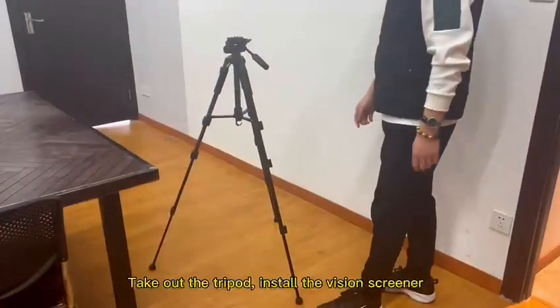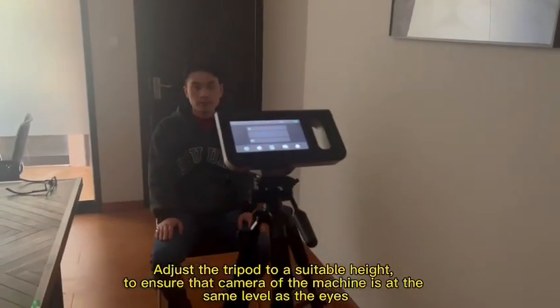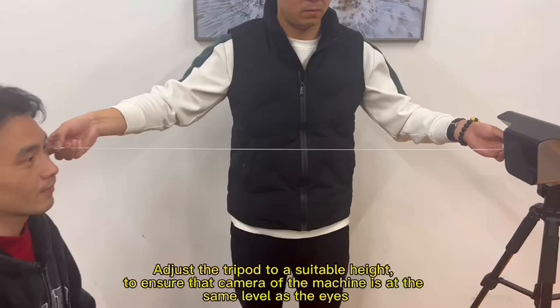Take out the tripod and install the vision screener. Adjust the tripod to a suitable height to ensure that the camera of the machine is at the same level as the eyes.